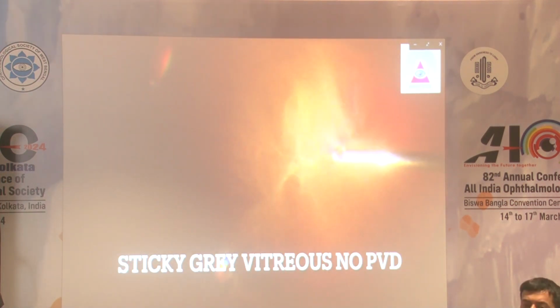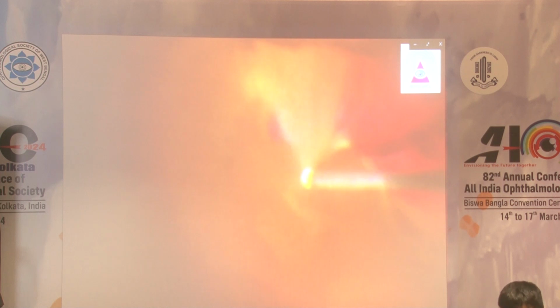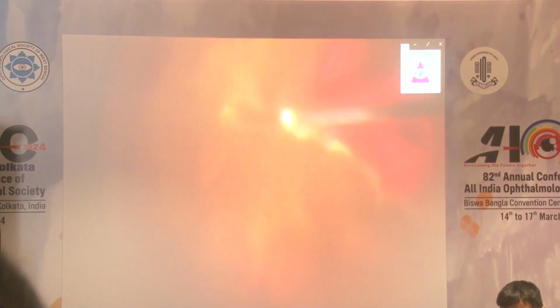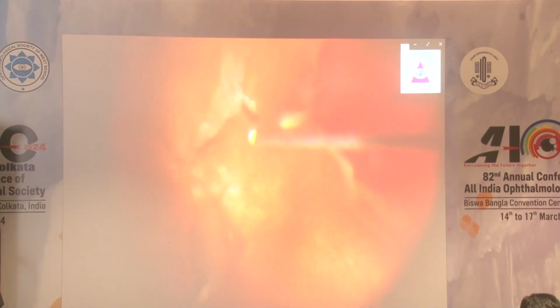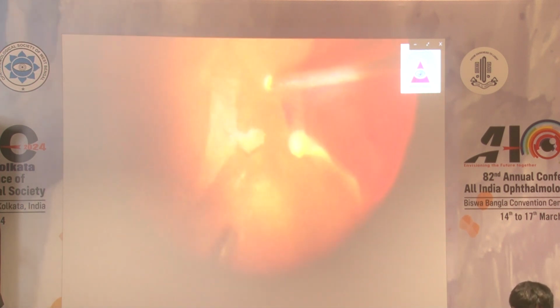The next case is of a sticky gray vitreous hemorrhage, which is a combination of old and new hemorrhage with no PVD. These cases are usually difficult as there is no posterior vitreous detachment and the vitreous is very sticky. Once you start vitrectomy with the cutter and the vitreous is thick and sticky, due to the thickness of the vitreous, the cutters might get blocked, and as the vitreous is very sticky, there are chances you might end up creating iatrogenic breaks or other intraocular complications. In these cases you have to be careful when you are close to the retina.